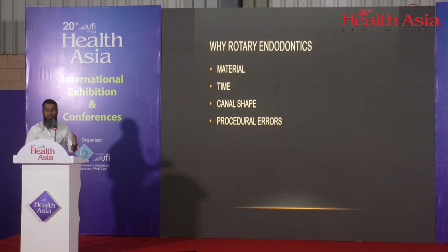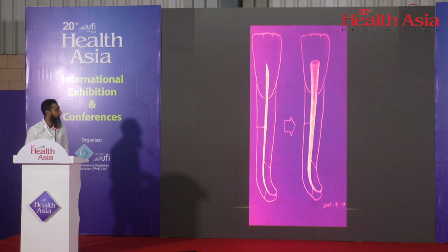And with rotary, the time can be reduced significantly. The shaping, like I told you, with the difference in metallurgy, the shape that you achieve with rotary would be far more superior than what you could achieve with your manual instrumentation. And because of the change in metallurgy, you will have fewer procedural errors also. Because with your stainless steel files, manual techniques, you have more chances of apical transportation, ledge formation, zipping. So these all can be reduced if you're doing rotary endodontics.